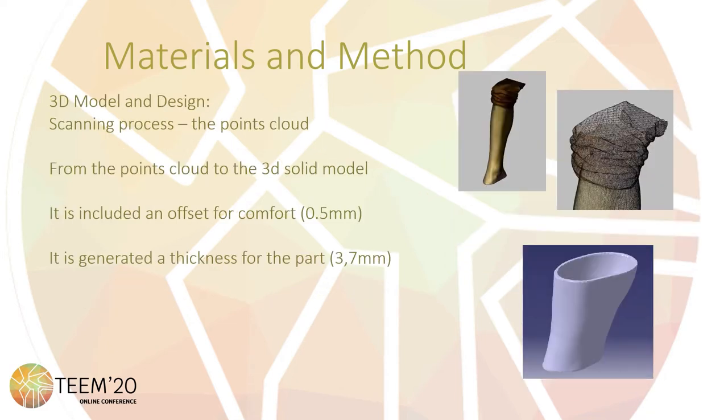The first part of the process is the 3D scanning of the injured part using a 3D scanner. In this case, a 3D Systems Sense scanner is used, which offers enough technical specifications to get a good quality 3D model. When the scanning process is finished, a 3D point cloud is obtained that must be cleaned and post-processed to get a 3D model. After that, an offset of 0.5mm is included so that the model fits with comfort, and a thickness is generated for the part.